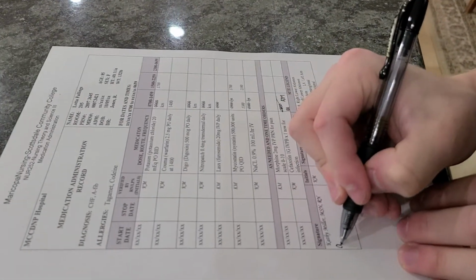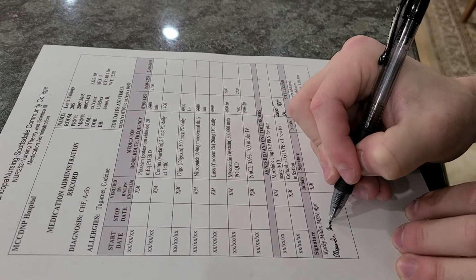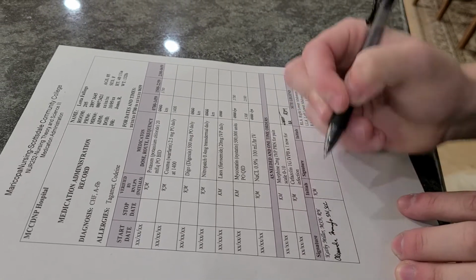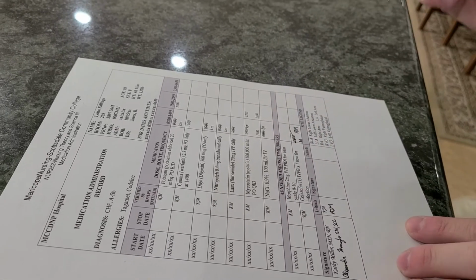And I'm going to sign my name, Alexander Nushko, SNSCC. And then I will put my initials so people know that I was the one who gave the med. And that is it for the skills video.